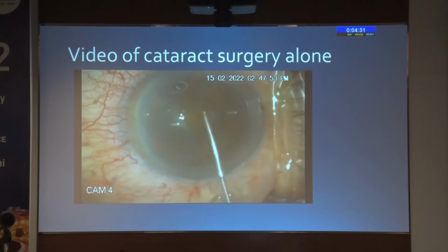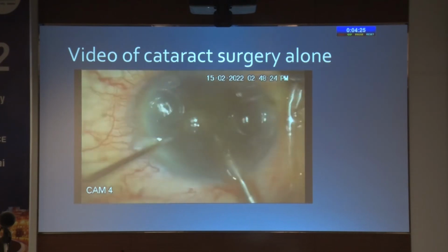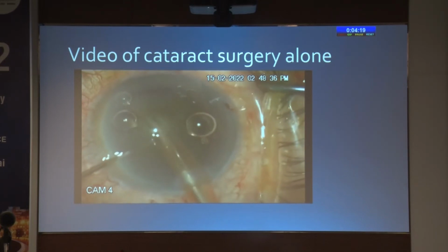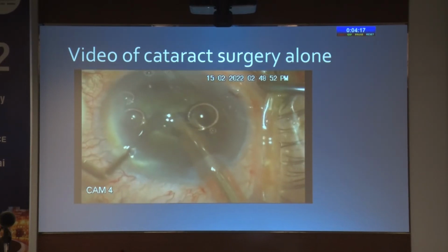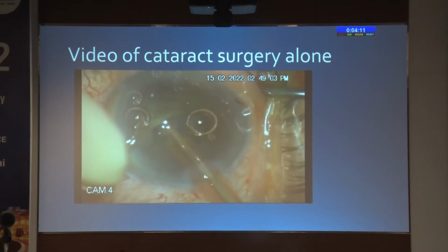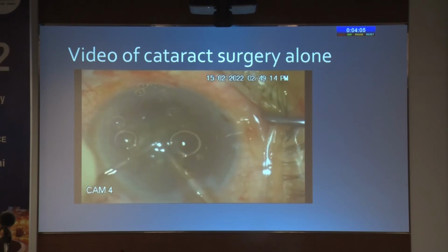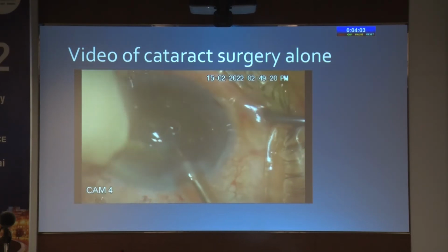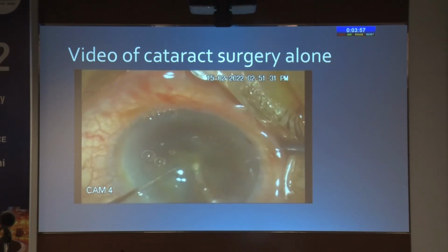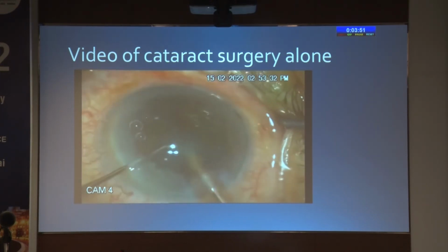While doing the nucleus delivery, the soft cell technique of using viscoelastic should be used, that is, a dispersive viscoelastic should be used to cover the corneal endothelium, and below it a cohesive viscoelastic should be used. For phacoemulsification, low power is always advised. Phaco chop technique and use of an oscillatory handpiece is always recommended. Use of viscoelastic during phacoemulsification will be beneficial for the patient.